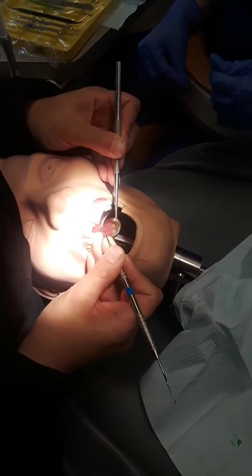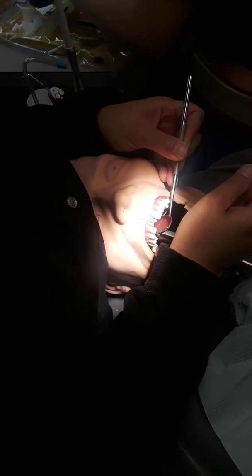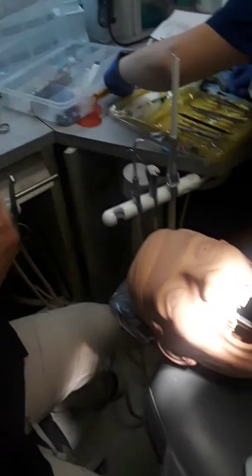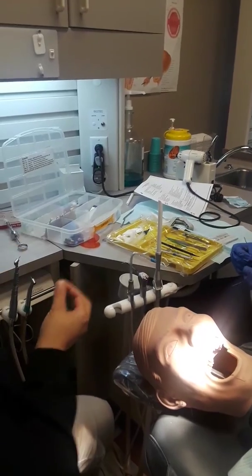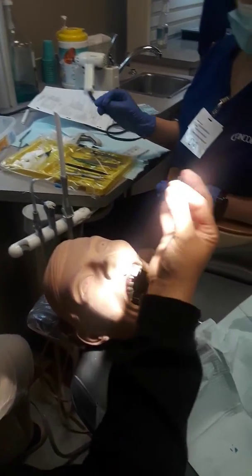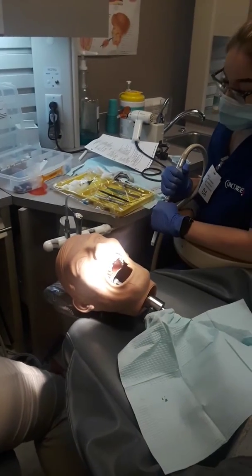The lingual doesn't look bad. Next: remove rubber dam — we already crossed that off. Pass composite finishing instruments — we have a finishing flame and a finishing football. I'm going to use the flame because I can access this area a little better.